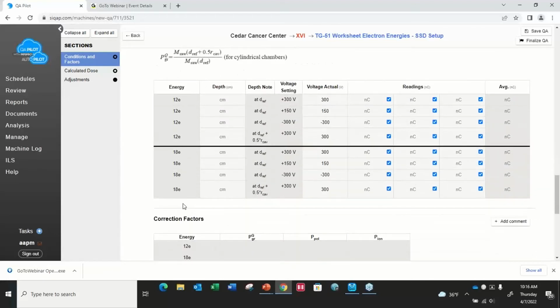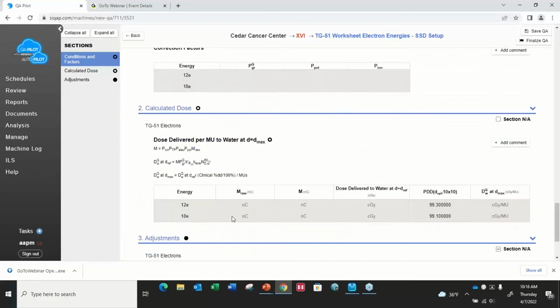We have created this one ourselves, but for any schedules that you create, you can also choose to embed instructions straight in the schedule that's being performed, so it's always viewable. You can also, when you set up your schedules, choose to provide a link to an external document as an instructional feature as well for those performing the QA at your site.